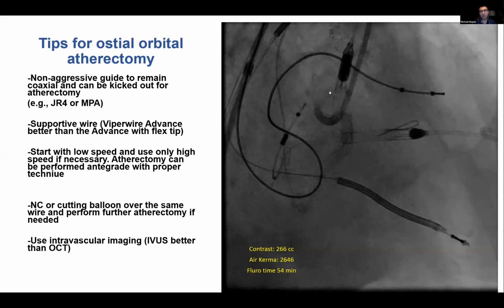I'd say it's very unusual, but it can happen. Then everything other than the atherectomy should be optimized. If you're radial, switch to femoral. If you're 6 French, switch to 7 or 8 French. Use a 45 long sheath. Use a very supportive guide.